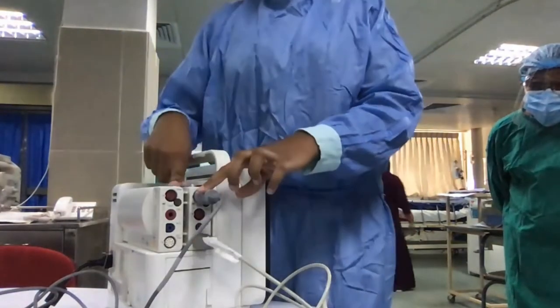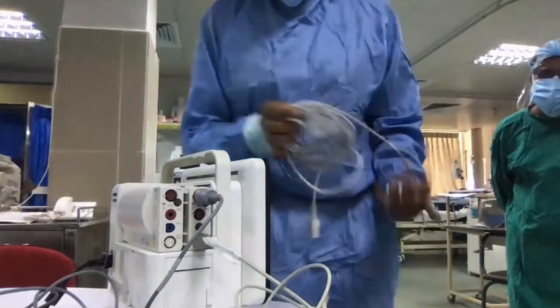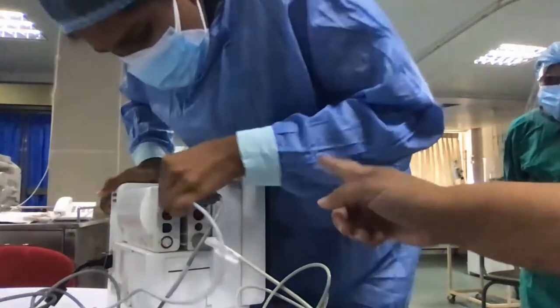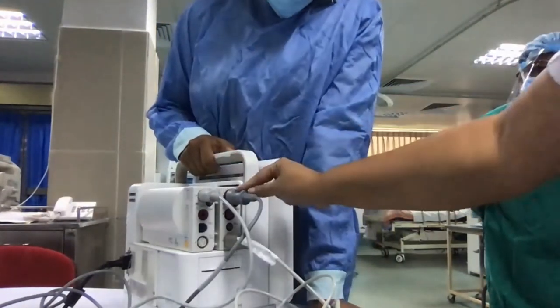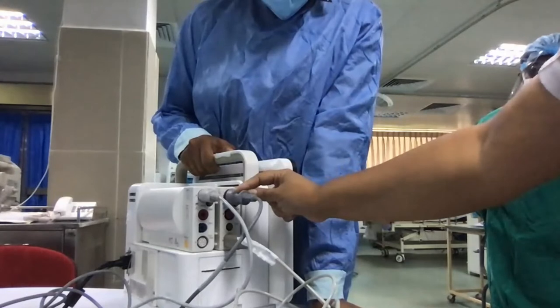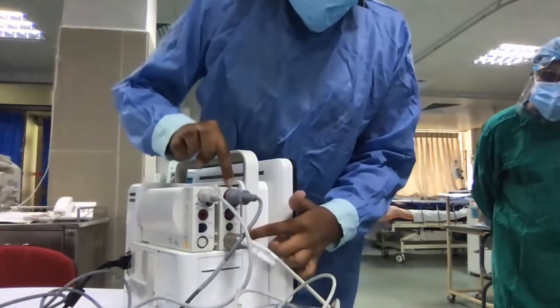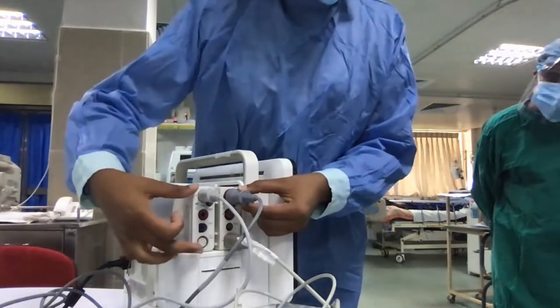And then you need another invasive pressure cable. For the moment I will connect this, but the port is different. Anyway, I will connect this one to the next extension, the other one. One will be for the invasive arterial blood pressure line, and the other one will be for the CVP. Mind you, the IBP that we get here is the femoral arterial blood pressure, because it comes from the femoral artery, and this is from the central line, the central venous pressure. So just remember: on the first extension you have connected cardiac output and the arterial line, and on the second extension you have connected CVP.